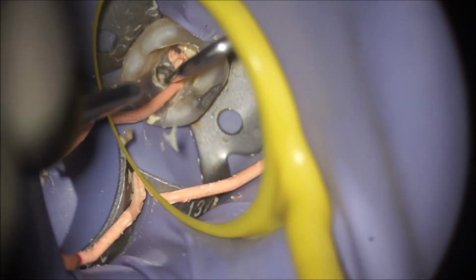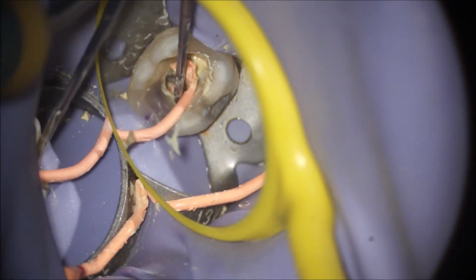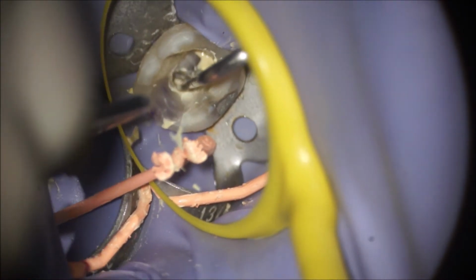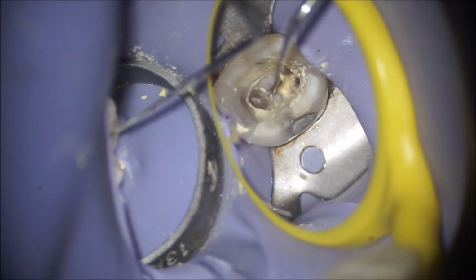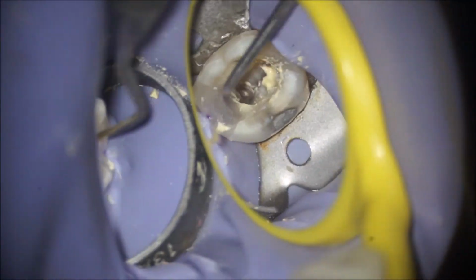So for obturating the distal, I chose to melt the GP at the bottom of the resorptive lesion. I think this created a much better orifice seal than what it would have if you tried to seal it at the top of the resorptive lesion. The canal was nice and round, and as you can see on the magnified view, it fills the spaces quite nicely. Continuous wave heat application, creating the apical plug.